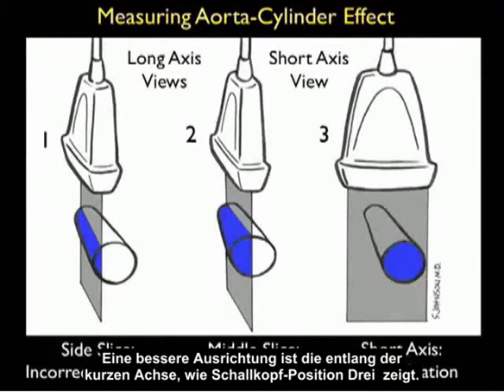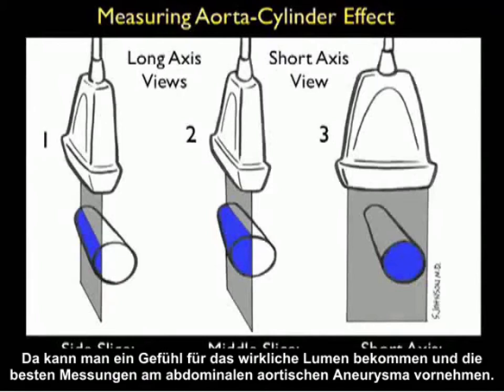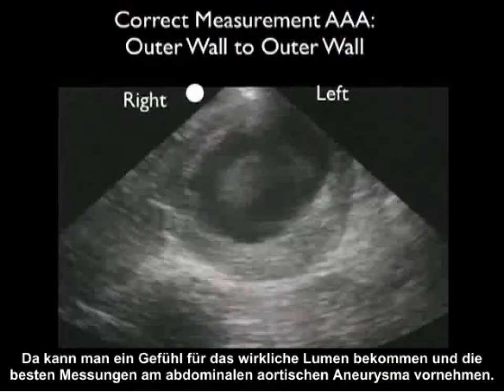A better orientation is to position the probe in the short axis configuration as shown in probe position three. One can then get a sense of the true lumen and get the best measurements of the abdominal aortic aneurysm.